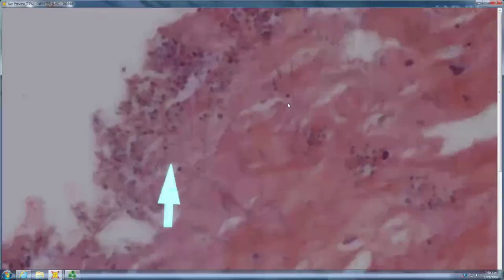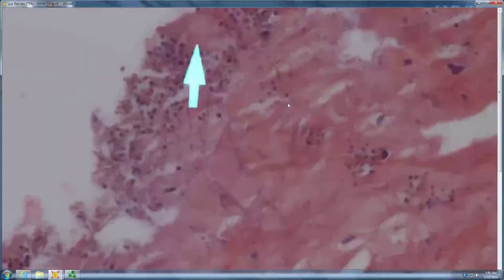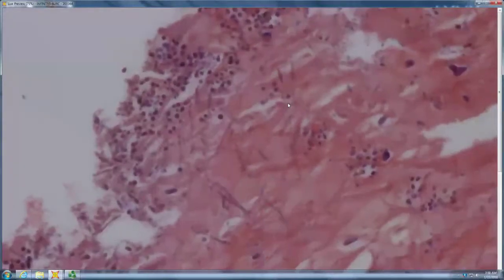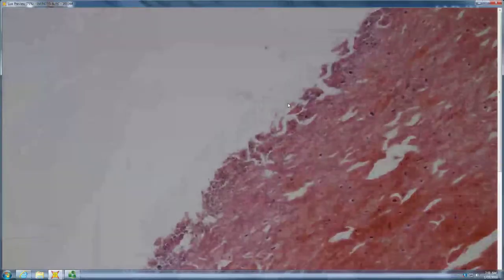Okay, so it looks like hyphal structures. All hyphal, or hyphae and yeast? Hyphae and yeast. In what direction are the hyphae? North-south. So what are you thinking? Candida. Candida, exactly. Mix of hyphae and yeast. The hyphal structure is going north-south. That's pretty good for candidiasis. Right? Candidiasis with that kind of massive hyperkeratosis, you think of chronic mucocutaneous candidiasis.